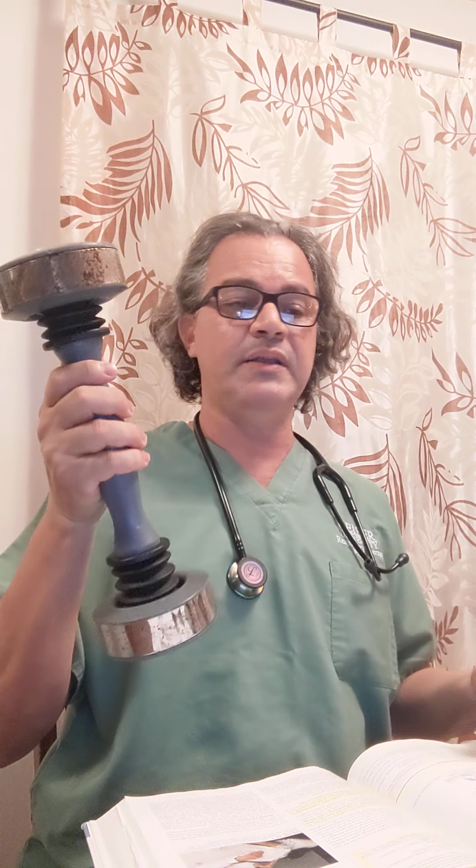If we put the equipment on the patient's back, where we have to work, it gives vibration, and we can use it for at least 10 minutes. It depends on the doctor's order. Sometimes they want it only once a day, sometimes twice, every shift change. Patients usually do not have this at home. They cannot take it because it's more for the hospital. It costs a lot of money, and they need assistance to do the therapy.